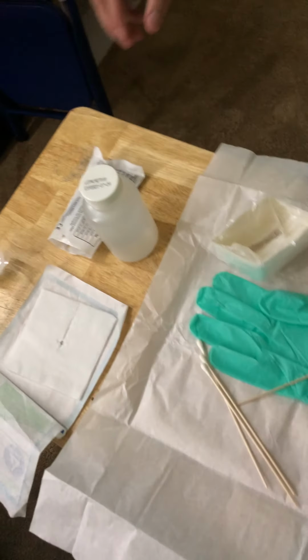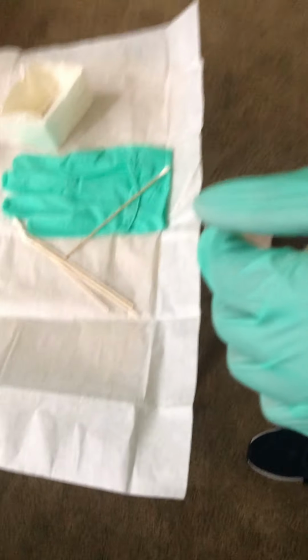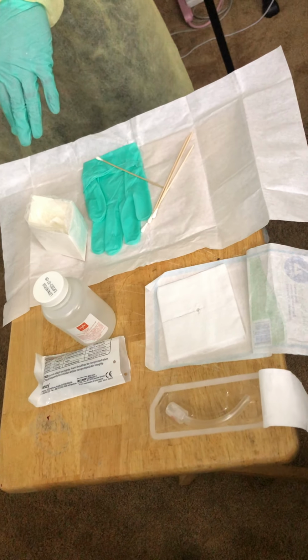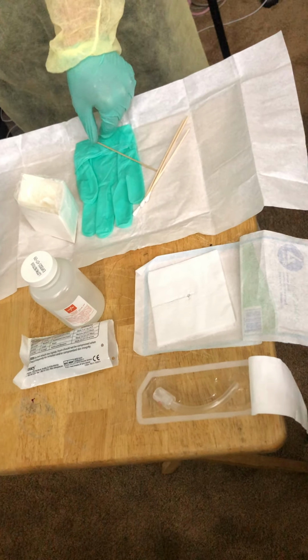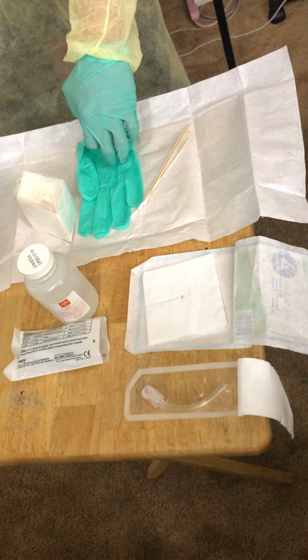And I am going to go ahead and verbalize that this is the only thing that's sterile in here, and it's going to have some weight on it, and if it moves, it shouldn't move because it should have saline in it and it will be heavy. So I'm going to dispose of this. So I only need 3. Put on my second sterile glove.